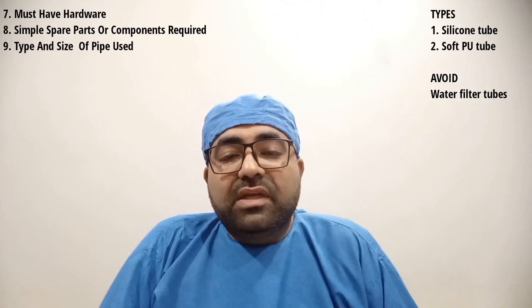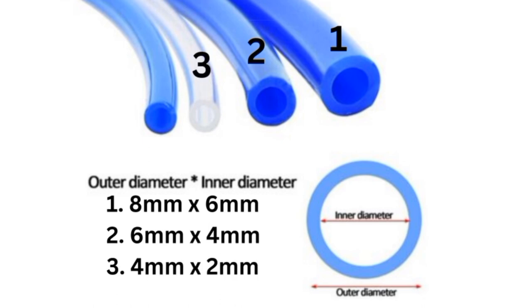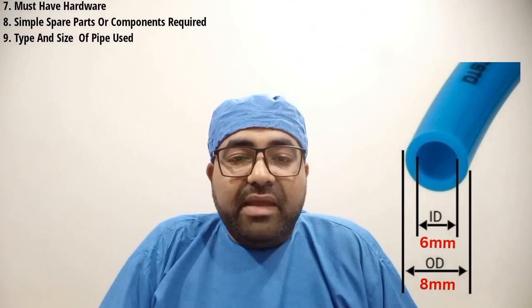The universal standard sizes of tubes used in dental chairs are: number 1, 8 mm by 6 mm tube; number 2, 6 mm by 4 mm tube; number 3, 4 mm by 2 mm tube; and number 4, 3 mm by 1.5 mm tube. Here, 8 mm by 6 mm indicates that 8 mm is the outer diameter and 6 mm is the inner diameter. I would suggest having at least one meter of each of these sizes in your dental clinic so that in case of any tubing damage you can change them immediately.